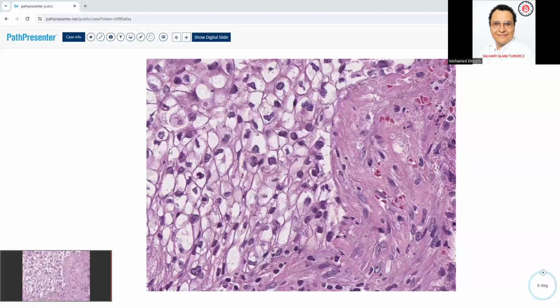Because sometimes we have a virtual slide, but it's not actually a virtual slide. They are spotting on a picture, so very spot diagnosis based. I will show you the picture. I think Abdurrahman would say that's very unfair. Okay, I think it's a clear cell.